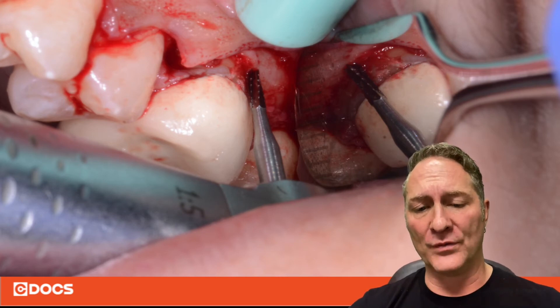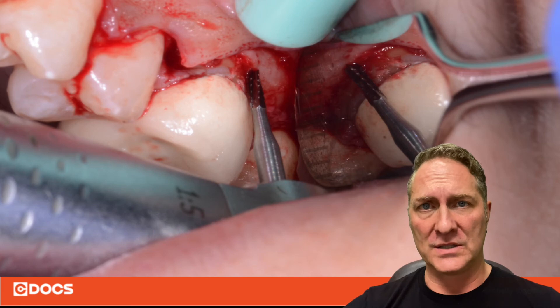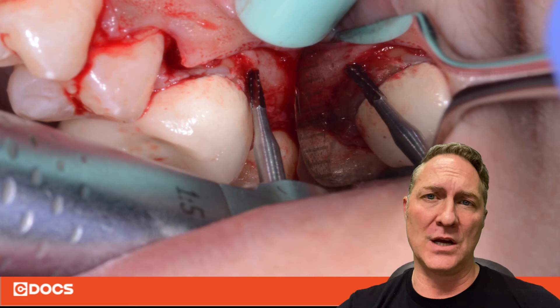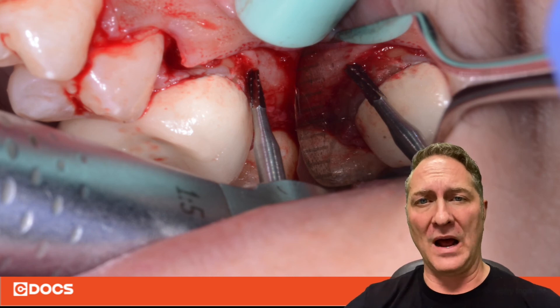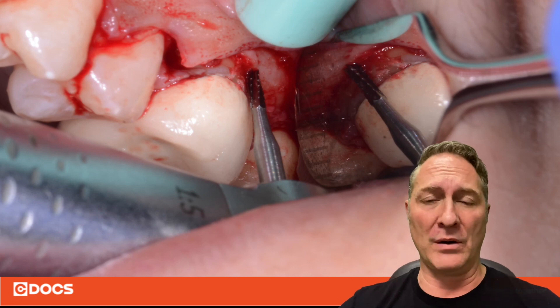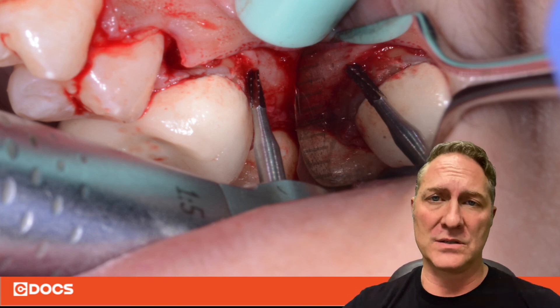If you can't get, or don't feel comfortable getting, complete sectioning, the other advantage to having that furcation exposed is when you go to place your elevators in. Instead of placing it in the coronal structures and trying to lever, actually drive it down into that furcation. That way, all of your force is going apically into the furcation of the root instead of up onto the coronal structures, and you'll be less likely to have the coronal structures break off, leaving you with a root tip — a root piece that you now have to get without anything to grab hold of. So it gives you a better purchasing point as well once you've exposed that furcation to get your elevator in there to then separate that root.